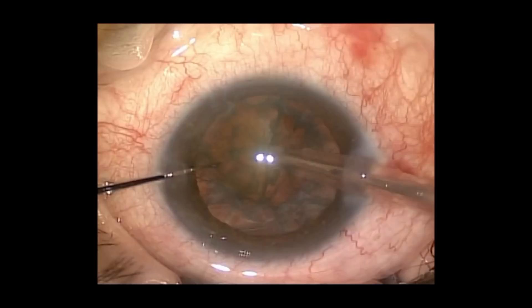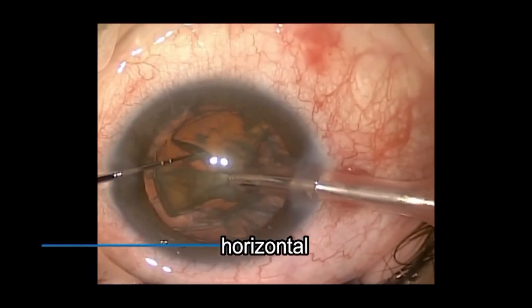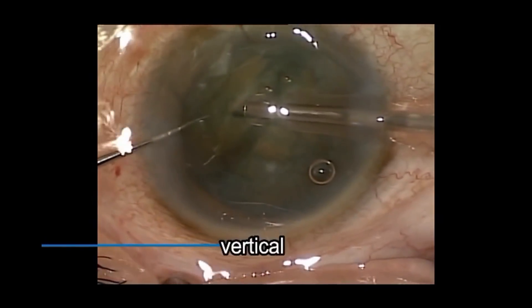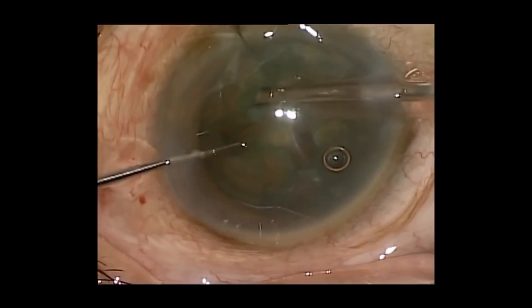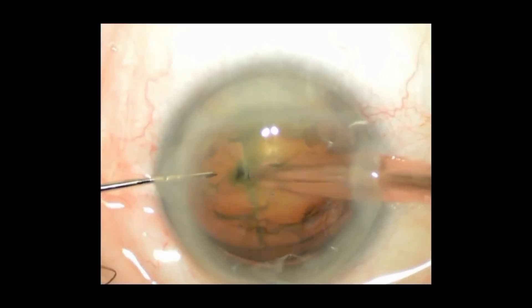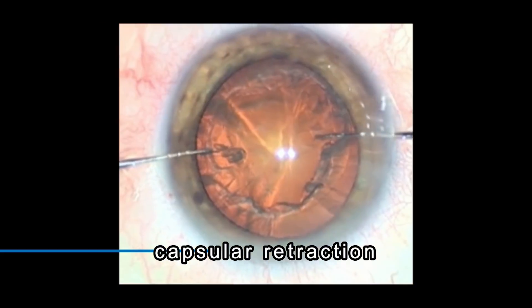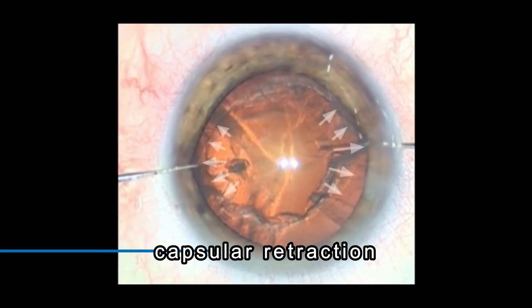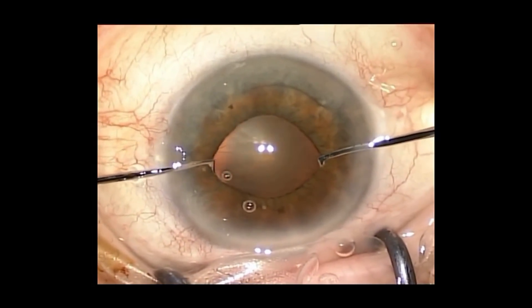In the quadrant step, this chopper can be used along with phaco, as a horizontal and also as a vertical chopper, according to surgeon's needs or preferences. Its posterior portion is blunt and smooth, and retracts the capsular bag's rim, allowing for nucleus splitting inside the capsular bag. It may also mechanically improve miosis in case of poor pupil dilation.